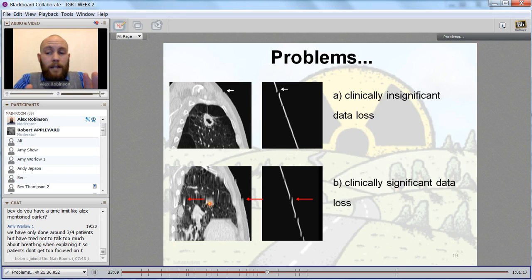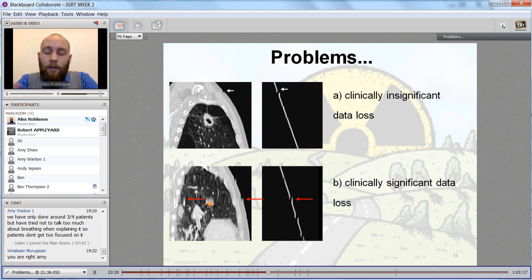One is to repeat the scan using exactly the same settings as before. So if halfway through the scan the patient had sneezed, I'd say that was a one-off occurrence, and if I repeated the scan, the likelihood of them sneezing in that area again would be minimal. So I could justify that repeated 4D scan. However, on this patient, as I said previously, you can see that there are multiple breaks all the way down the rod. So even if I repeated it, the likelihood of that occurring again would be quite high. And then what we're looking at is 4 or 5 times the dose repeated.